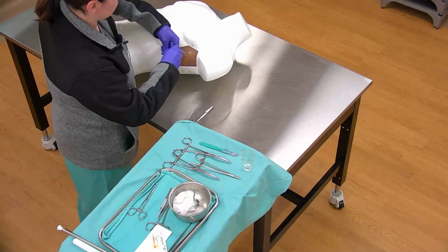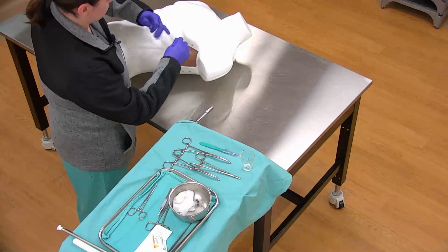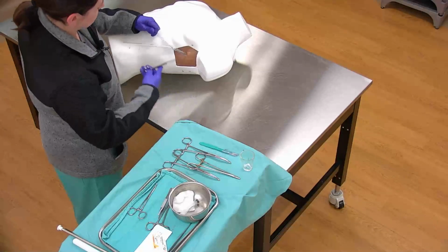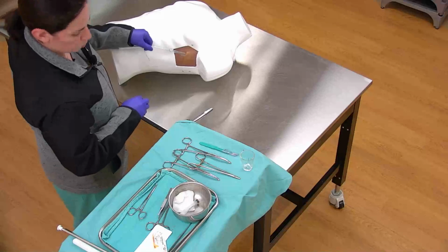I usually use a pretty heavy suture, like a No. 1 Ethibond or an O-Prolene. Less than that, it's pretty easy to rip your sutures out. After it's secured, you would connect it to an Atrium, which we are not going to show. But here you can see the tube is well secured.